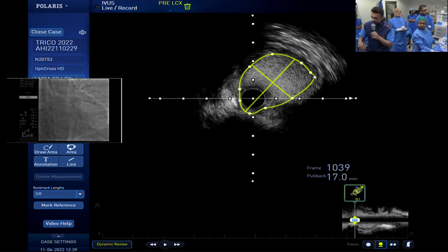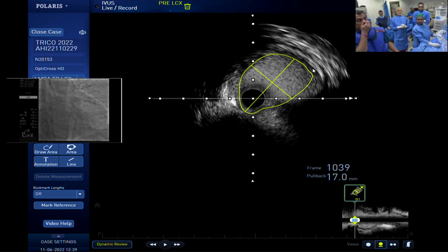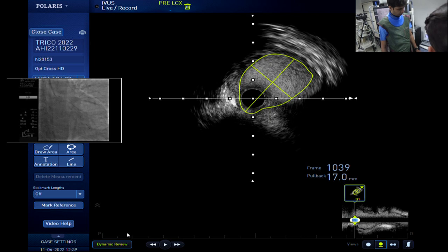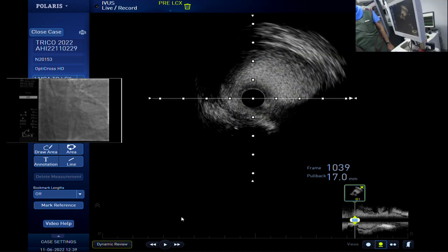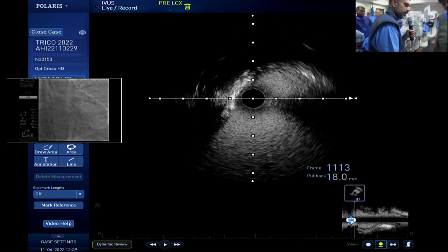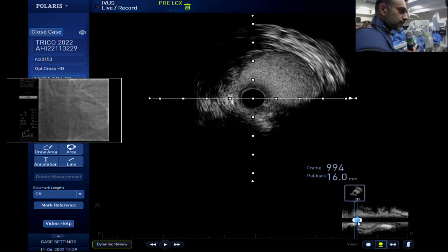So can I just come around here just a little bit for a second? And may I? One of the other strategies that you can use, if you've used dynamic review, is I would turn this off. You can delete here, and then actually just take your slider and slide back and forth, right? So do you see here, you almost wonder if it's getting tight, but you're actually outside of the vessel.